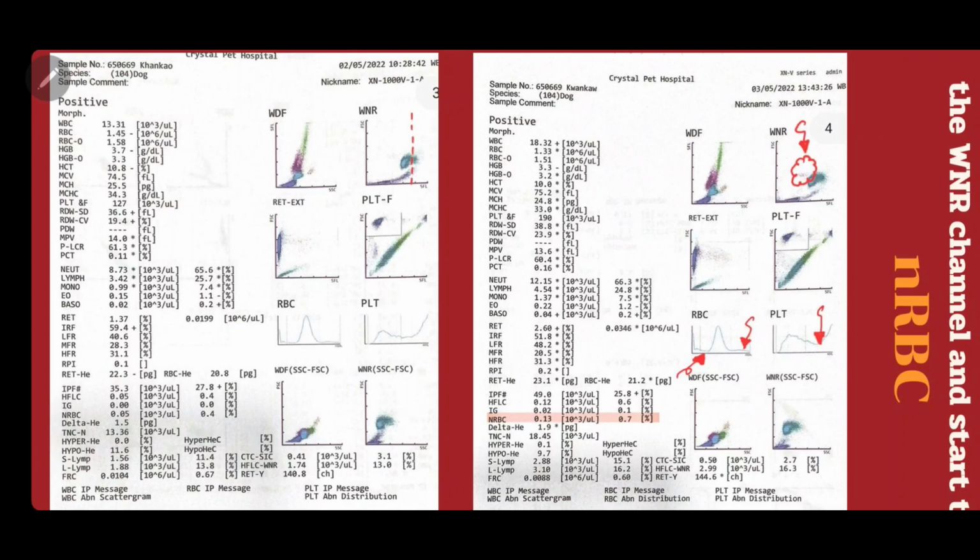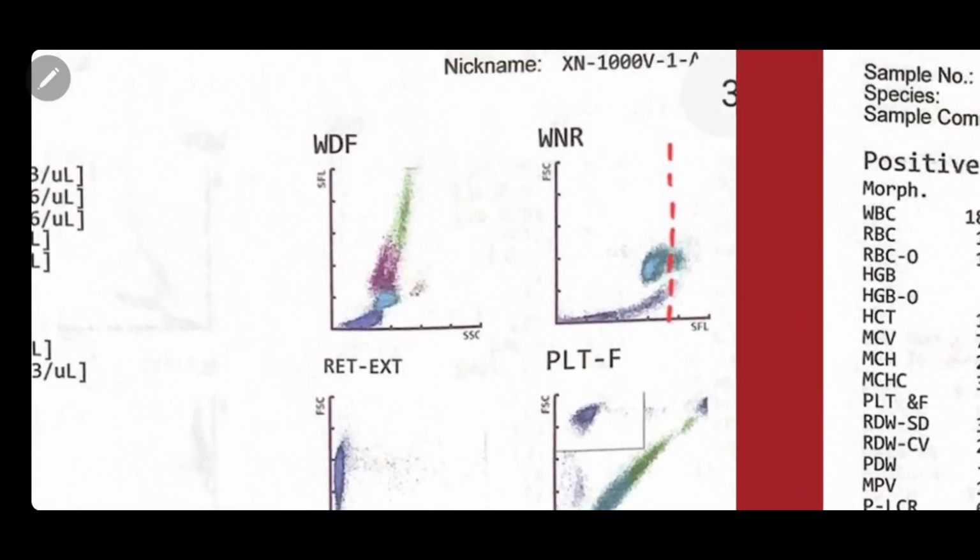Let's look at days 2 and 3 after IMHA symptoms appear. The first thing we need to see is the WNR channel. As I mentioned earlier, it should exceed the 3.5 mark here. You can see it in channels 1, 2, 3, 4, and 5, with 3.5 being significant.